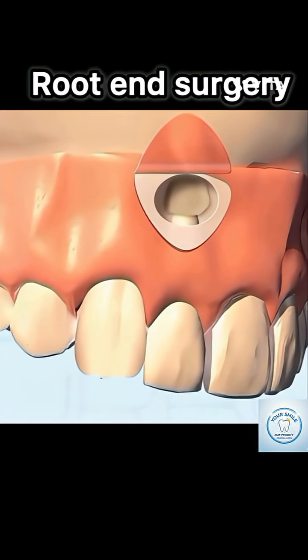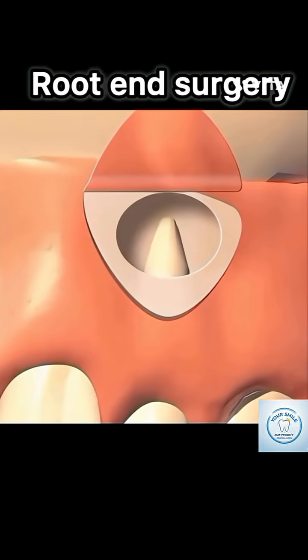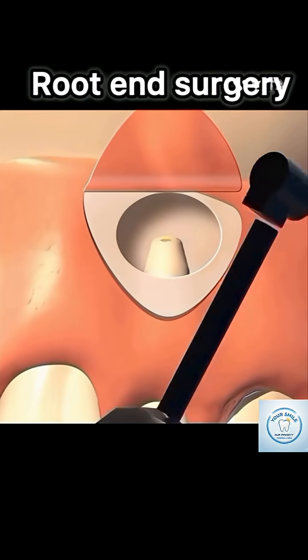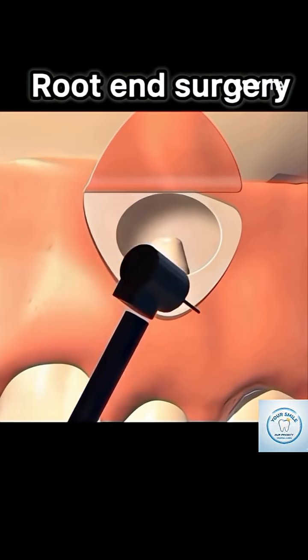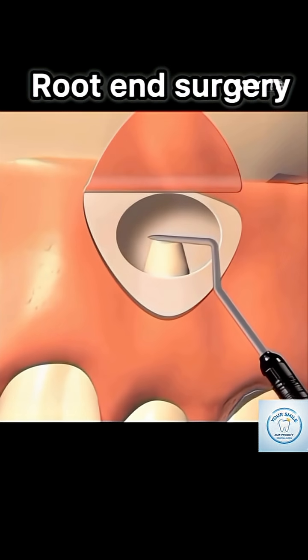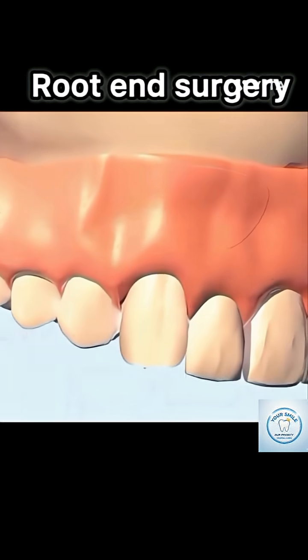Next, a small window is made in the bone — an osteotomy — to access the diseased periapical tissue and the root apex. The surgeon then uses a high-speed handpiece to remove the infected tissue and resect the last 3-4 mm of the root tip at a slight bevel.